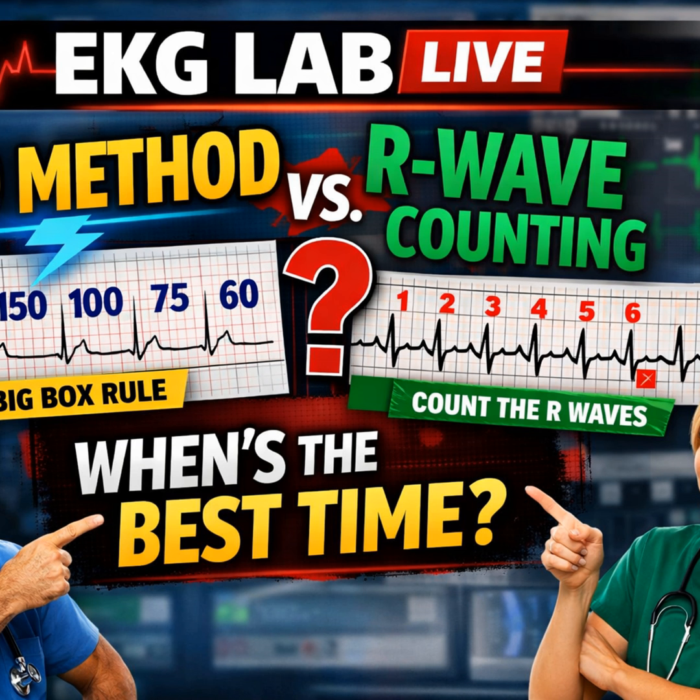All right, well, let's break down the mechanics so everyone's on the same page. My position rests on this idea of analytical decision-making from that NIH study. The big box method uses the paper speed. The paper moves at 25 millimeters per second. Which means one large box is 0.2 seconds. Exactly. So if 2 R waves are one large box apart, the rate is 300. 2 boxes, it's 150. 3 boxes, 100. Then 75, 60, 50, 43.